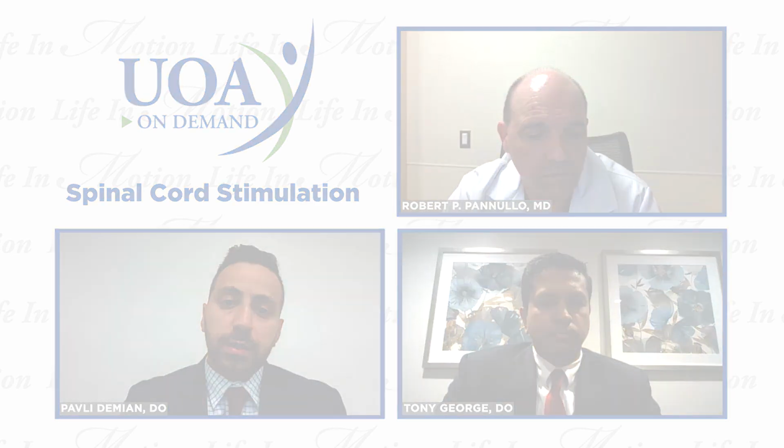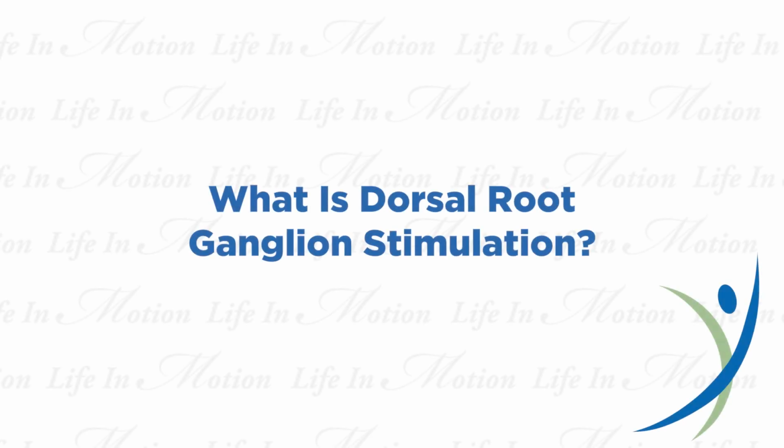Dr. George, concerning dorsal root ganglion stimulation, can you speak to that at all? Sure. Dorsal root ganglion stimulation is a fairly new mode of stimulating a specific region close to, adjacent to the spine, where the dorsal root ganglion is, with a collection of nerves that sit in that region.